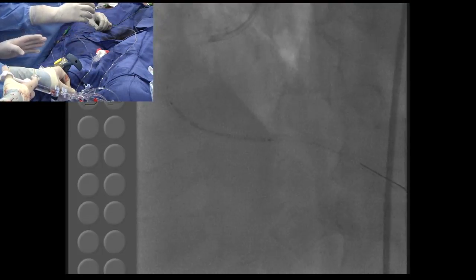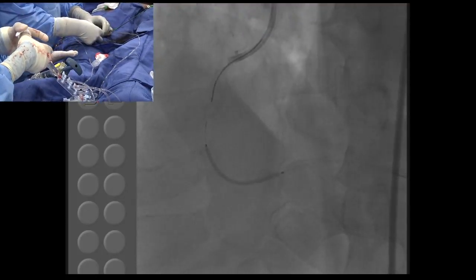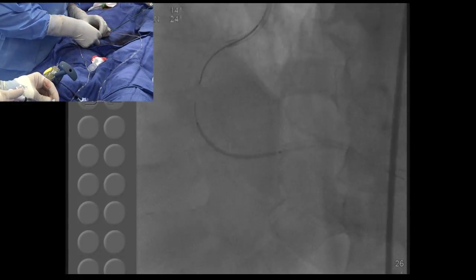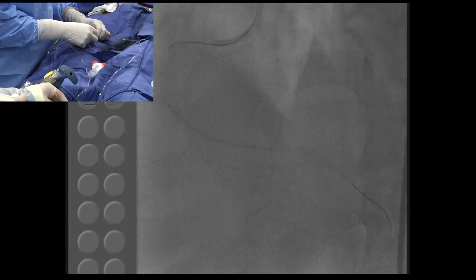I'm going to show, we'll take the other wire out. But clearly when you use the buddy wire, although you can leave it, it's never the issue. Want to take a picture now? Yeah. Either you come back a little bit or go forward a little bit. Yeah, I would go a little bit forward because we need one more stent for overlap anyway. Necessary the stenting. Good, good, that's good. Going up.